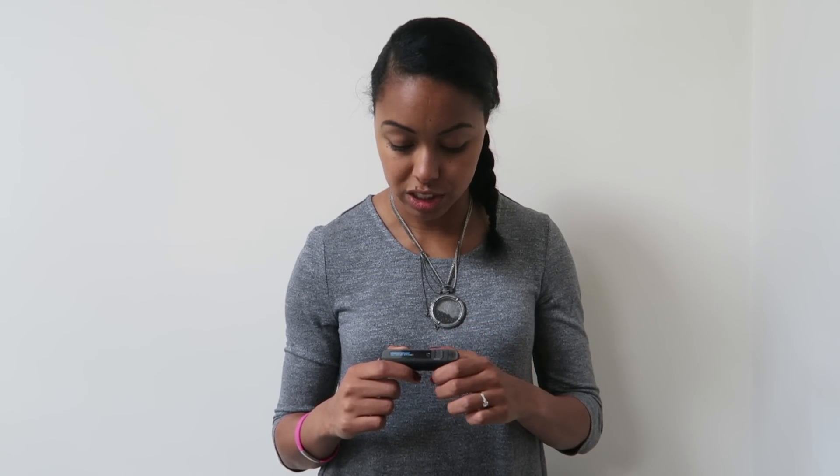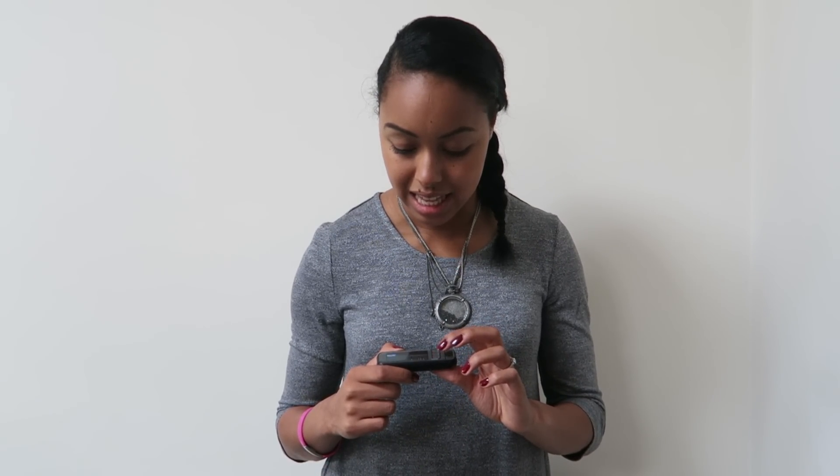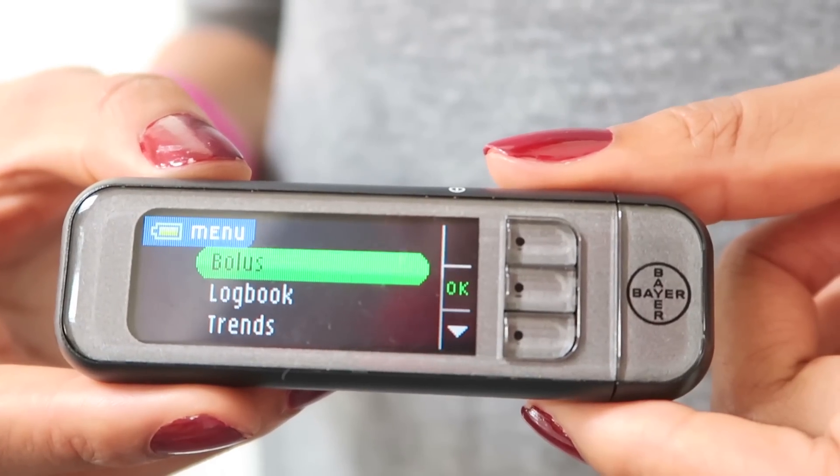Going back, it says cancel because I'm not actually doing a bolus right now. You can also do a preset bolus — so if you have breakfast at the same time every day and you want to preset a certain amount at a certain time, that's something you can also do.